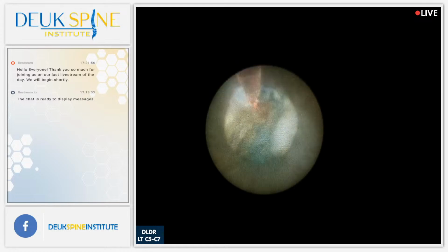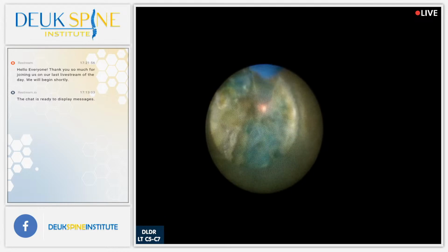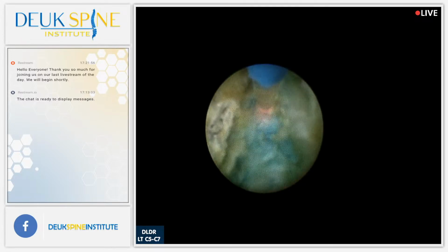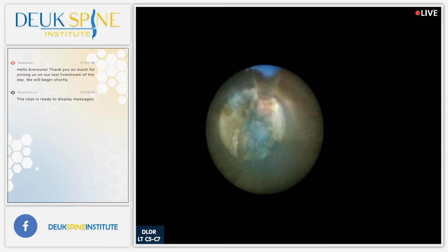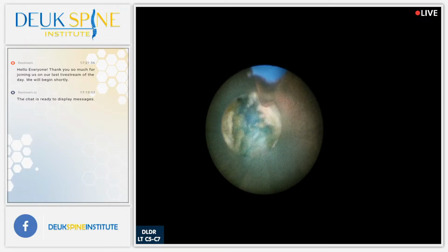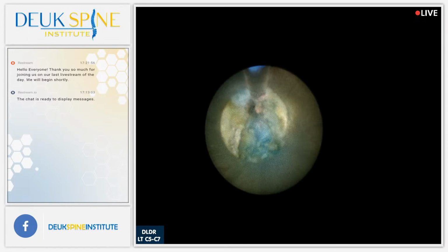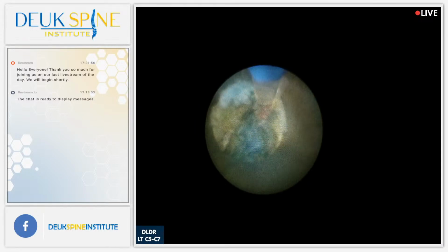She's really relaxed, right? Can we check it? Because we're fighting a lot. I'm just wondering if some of this is muscle relaxer. How many twitches? I got 0. All right. Could be, or just could be her anatomy. Her chest is big. I gave her a big dose. No, you don't need to give her any more. You got 0 twitches. I don't want any more.